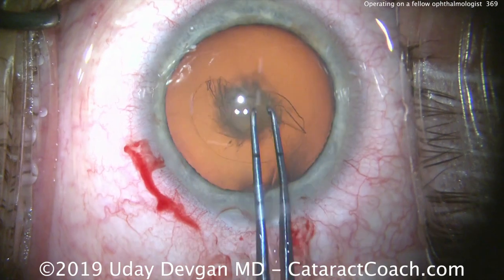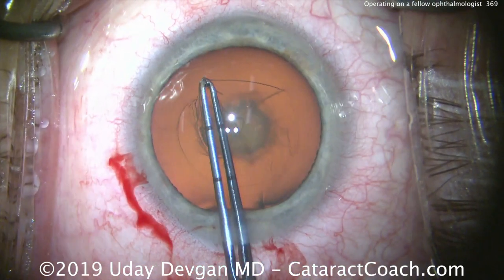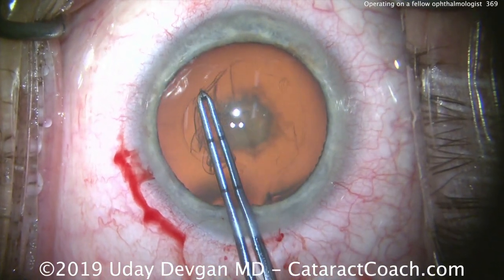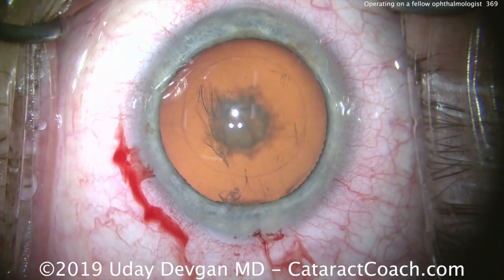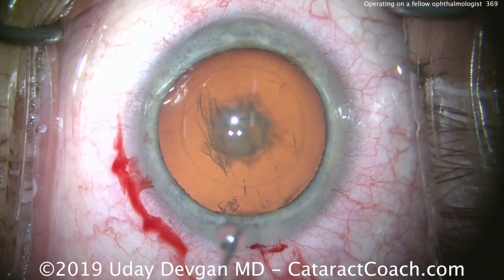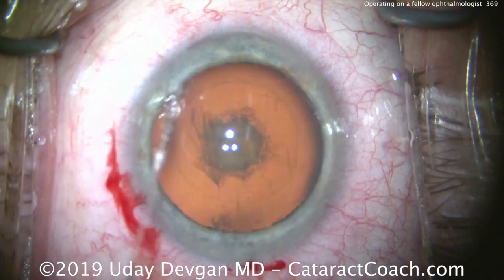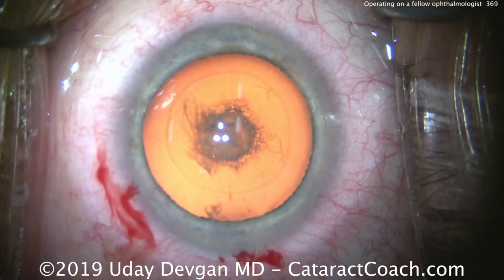And again, anesthesia here is just topical with that little bit of intracameral lidocaine, as well as intravenous anesthesia of 1 or 2 milligrams of Versed. So there's the rhexis, and that looks pretty good. Notice the blood from the incisions. I like that. I like to barely nick the limbal vessels. That means great long-term stability and healing.